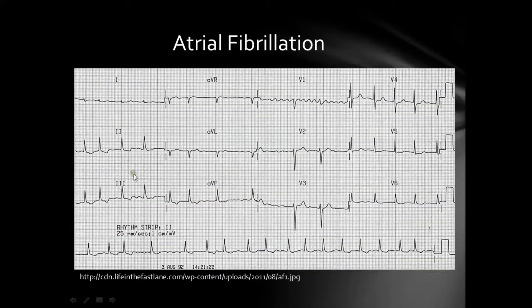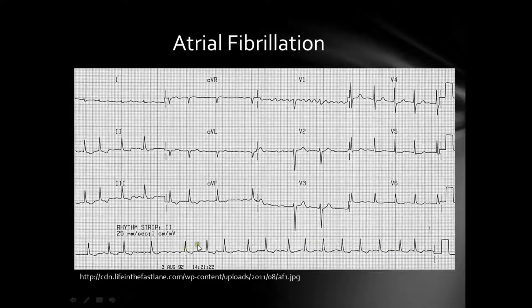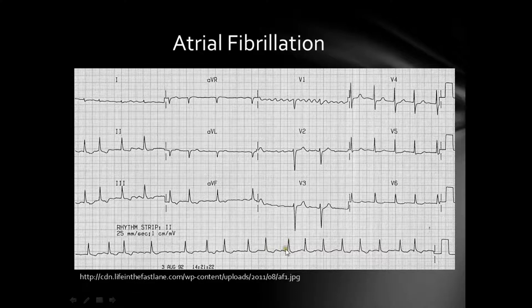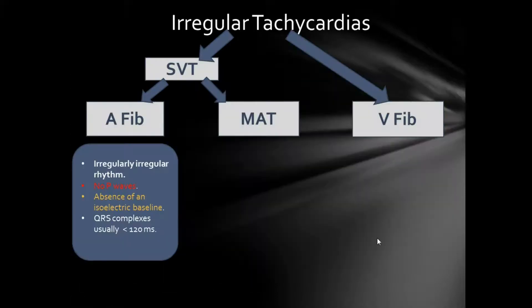Here on this ECG, we can see a typical atrial fibrillation. First, the rhythm is irregularly irregular because the R-R intervals are changeable with each beat. The second thing is that you have a narrow complex tachycardia because of the narrow QRS complexes. And the third thing is you do not have distinct P waves, but simply a fibrillatory baseline.